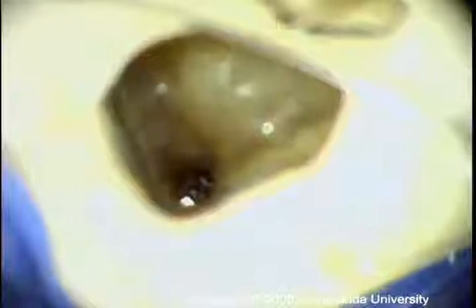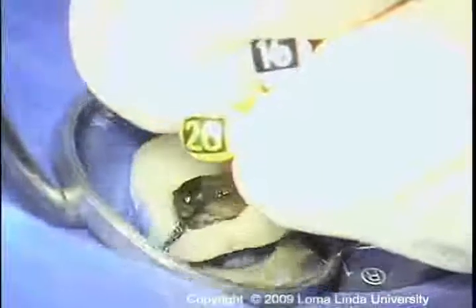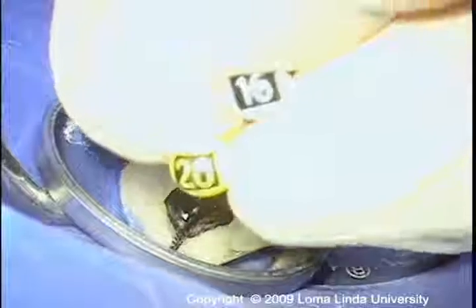Once enough space is created that two files can be inserted, the files can then be braided around each other, usually in a counterclockwise direction until tight. Then coronal pressure is applied in an attempt to deliver the file from the canal.